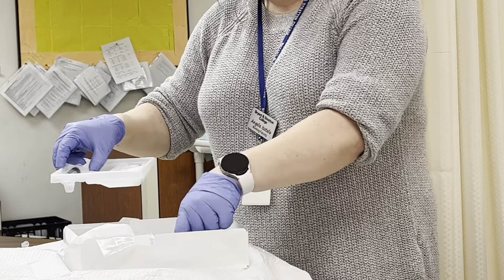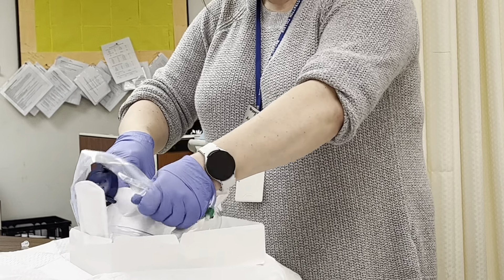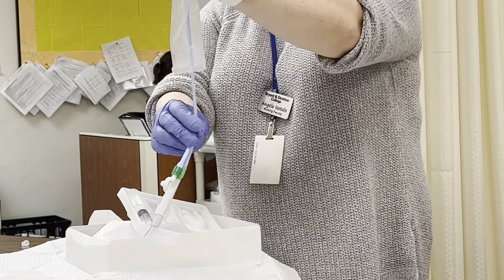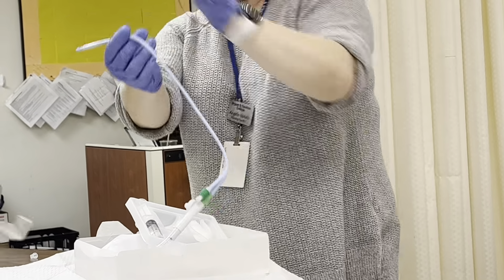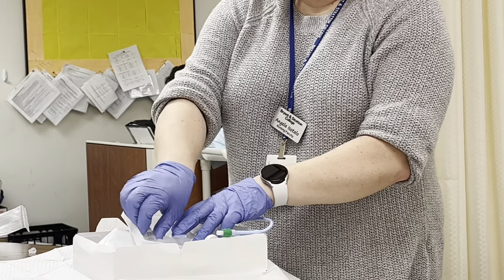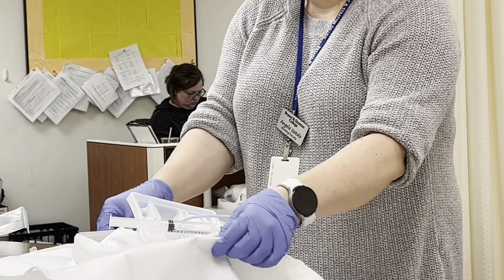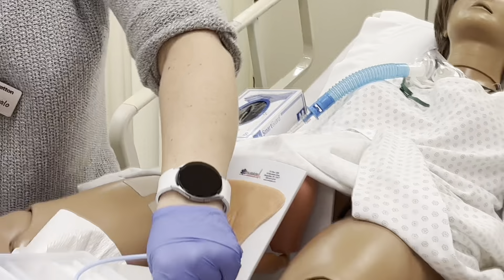I'm going to remove my tray. I'm going to make sure that my bag is closed — it's tucked closed. I'm going to take the catheter out of the plastic and just pull it down, then dip it inside the lubrication. I'm going to stick the syringe onto the end. Now I'm going to take it by my patient — I'm going to pinch the sides and use my thumbs on the side of the box and bring it towards my patient.